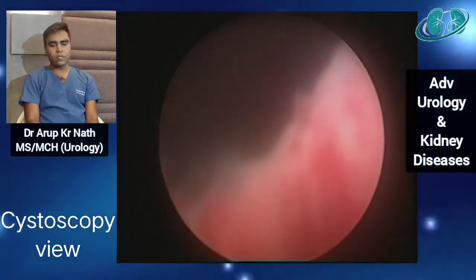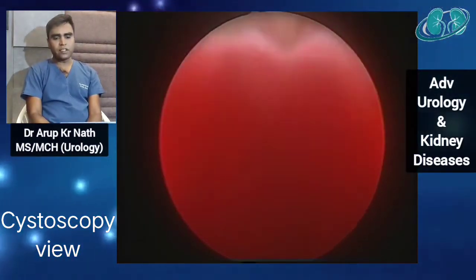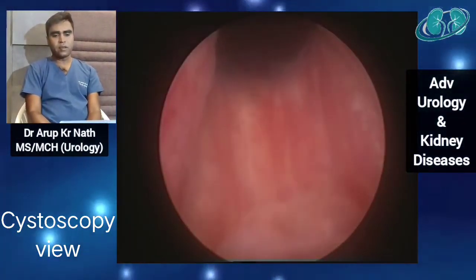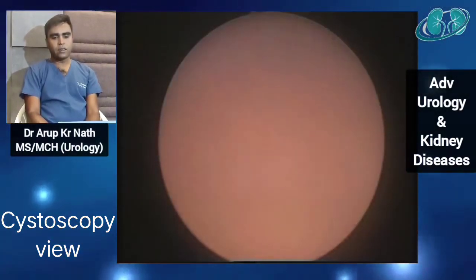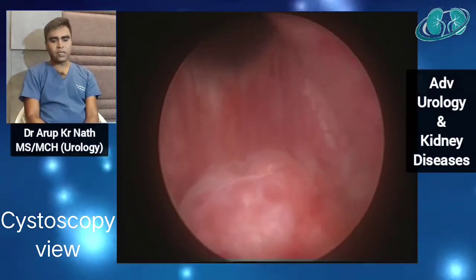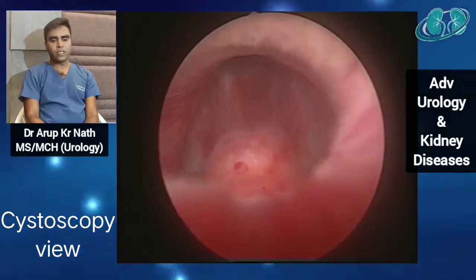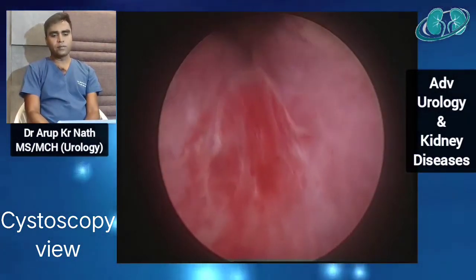While coming out, after the prostatic urethra, you can see the verumontanum and the external sphincter, which is quite well visible, but there are some signs of inflammation at that urethra. In the prostatic and in the membranous urethra, there are some signs of inflammation. That may be the cause of burning urination and frequency in this patient. The rest of the urethra is visibly normal.